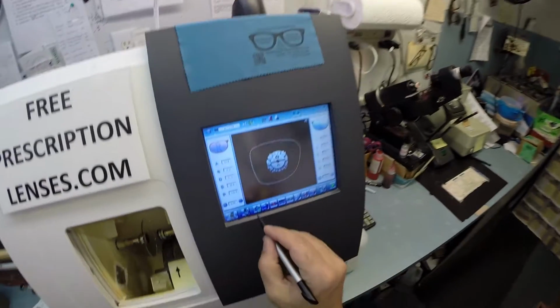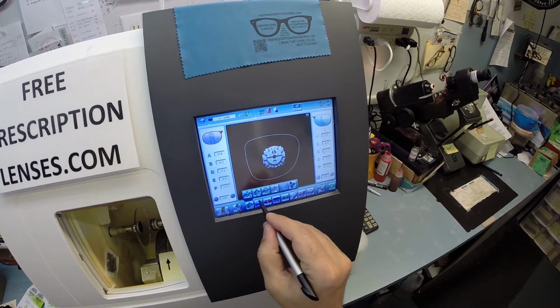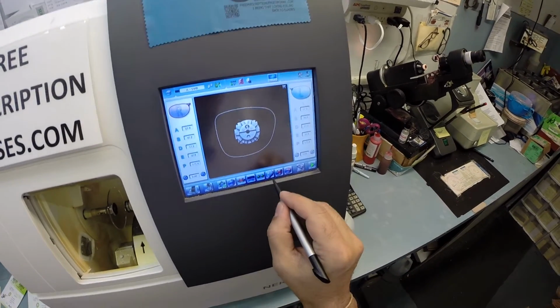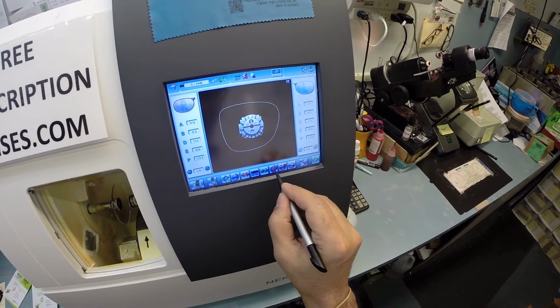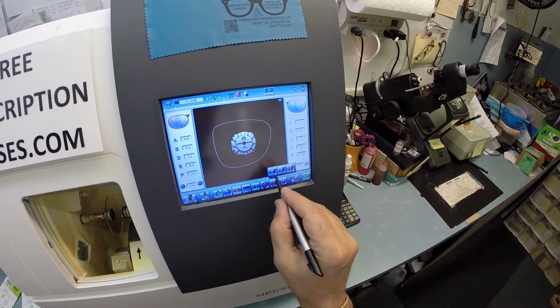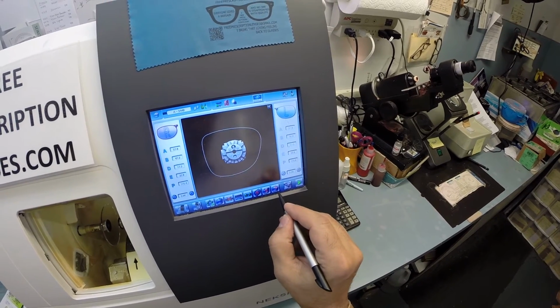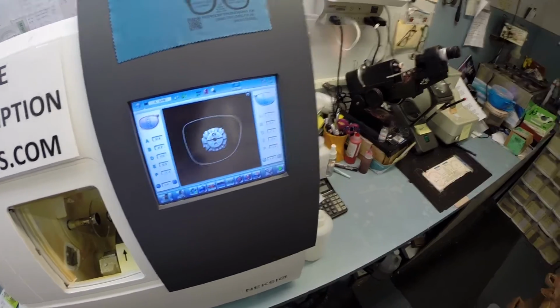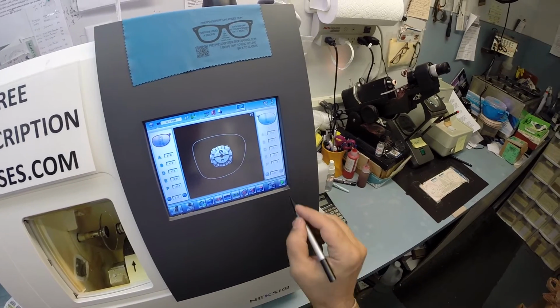And these are polycarbonate lenses. If they were plastic, high index plastic, or Trivex, I would select that, but we're going to stay on polycarbonate. I do not want to polish the edge of the lenses because they're not going to be seen anyway in this frame. I do not want to put a bevel on the front surface, the convex surface of the lens. I'm only going to put a safety bevel on the rear concave surface of the lens. And that concludes the vocabulary lesson of the day.